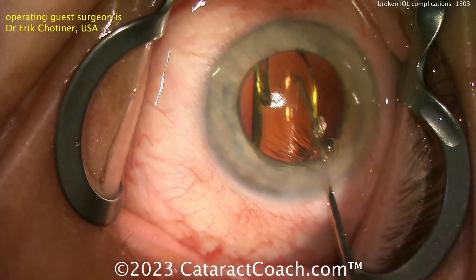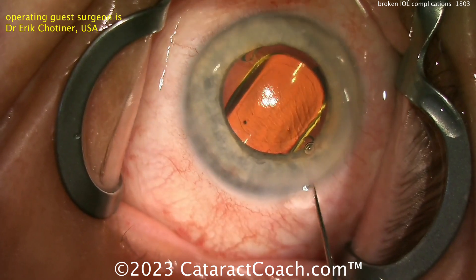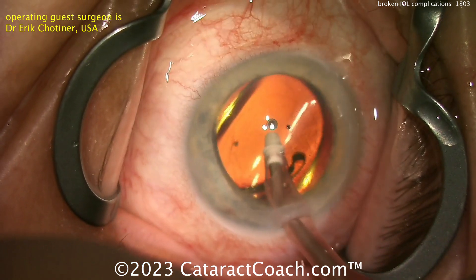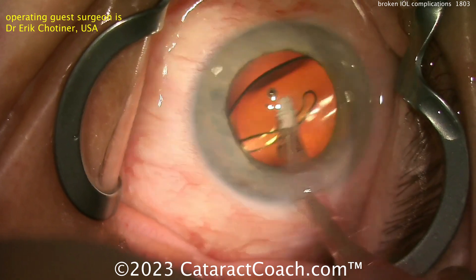Give it a moment, get those haptics to open up and start to deliver this thing, get it rotated and rotate a little bit more — it looks pretty good, right? IA probe coming inside the eye, everything looks pretty routine. You can see it's a beautiful exit. Whoa — why does that haptic come back? It was already opened.